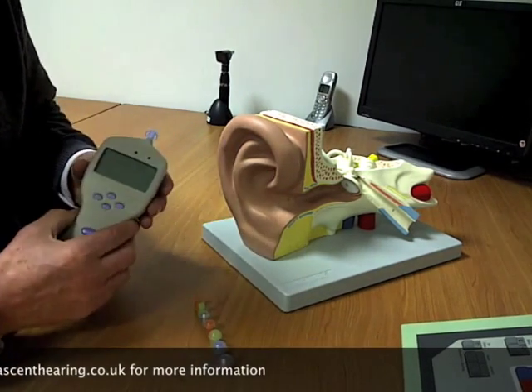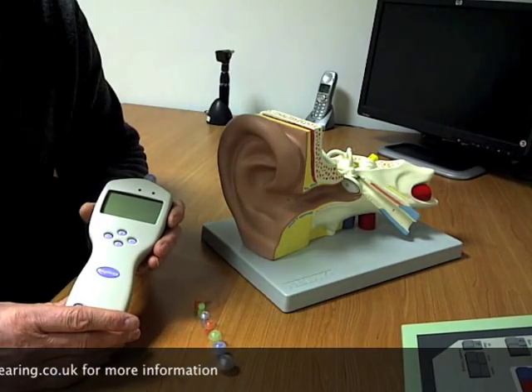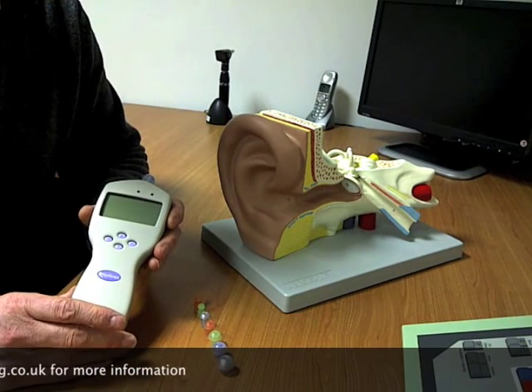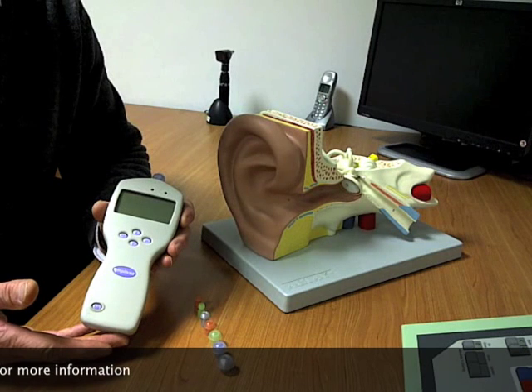For the purposes of this particular video, what we're looking at here is simply the ear — the conductive part of the ear that we want to assess how well it's working — and an example of the hardware that could be used to do that measurement.